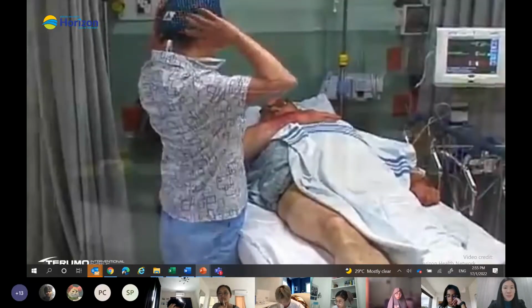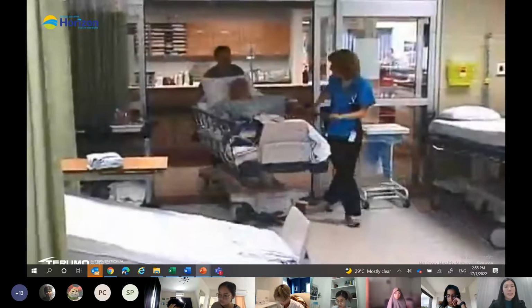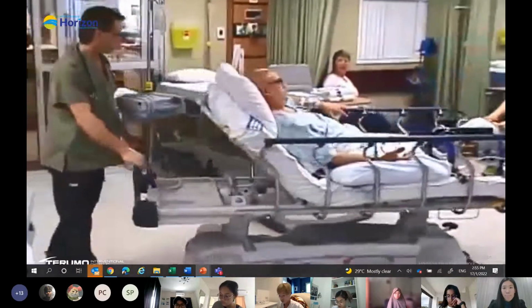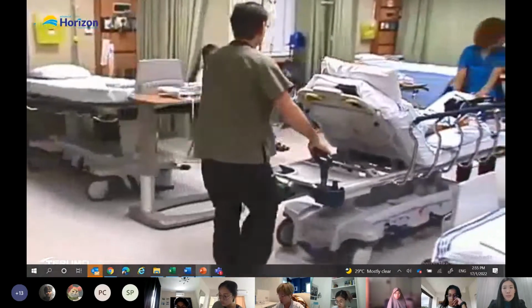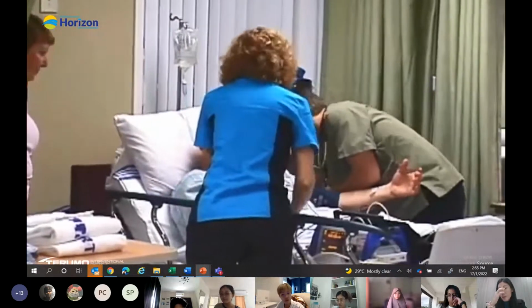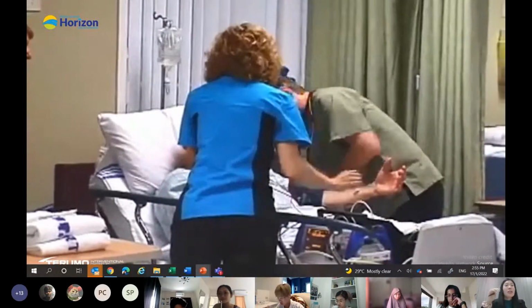Okay. So at the end of the procedure, basically move back to your patient ward. And again, check for your vitals, check for stability. I think from here, it's quite straightforward. So that's the patient's journey. So for patients, that's what they will experience.